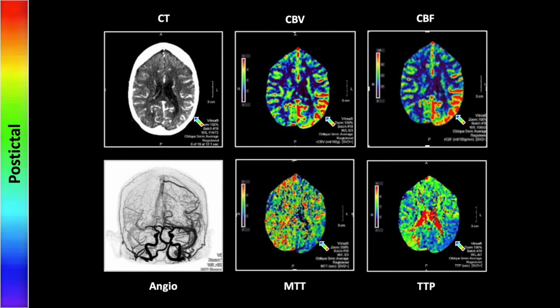Our last case is a post-ictal patient where the left temporal occipital region is apparently the focus of recent seizure activity. You can see even a little prominence of the vessels on the contrasted CT in that region, and that is manifesting as increased cerebral blood volume and increased cerebral blood flow. So certainly that is not the typical appearance of an infarct, although it is notably asymmetric and regionally prominent. The MTT and the TTP are both depressed here, which may represent the effects of regional autoregulation. On the angio, you can also see the prominent vessels on that left side in the early venous return.